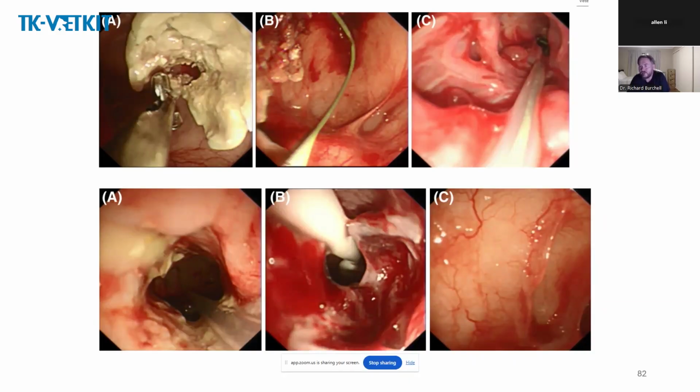You cannot visualize the opening to or get into the frontal sinus of a normal dog unless it's got a destructive disease like mycotic rhinitis that has eaten out the nasal passages and eaten out the opening to the frontal sinus.